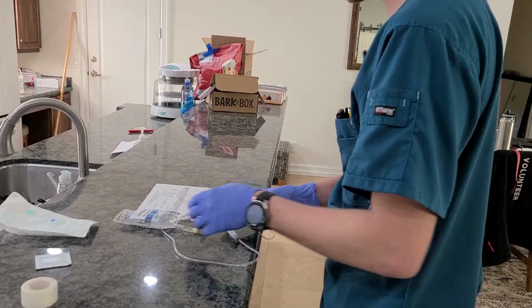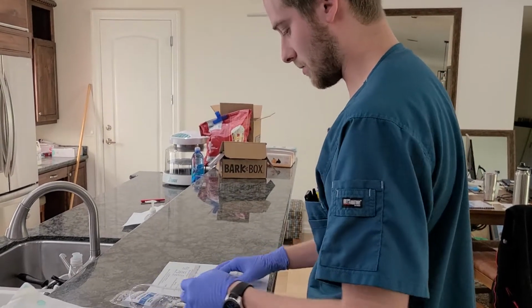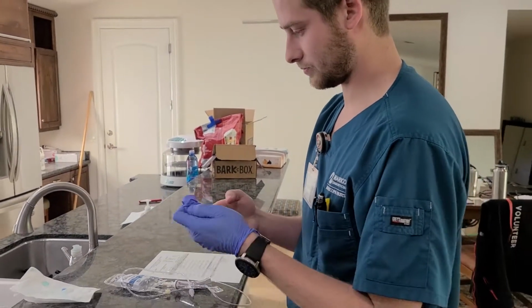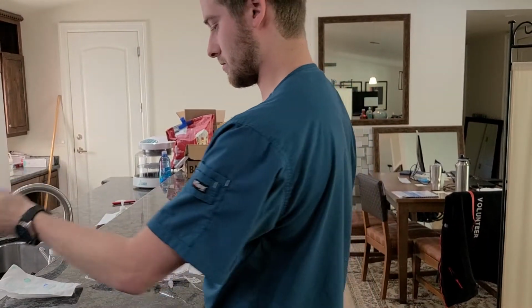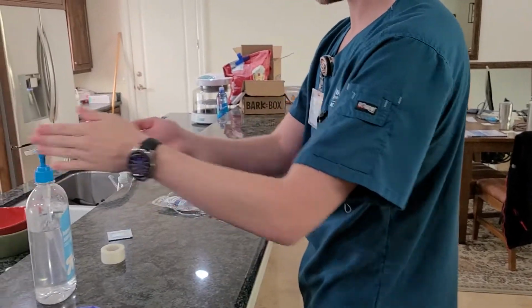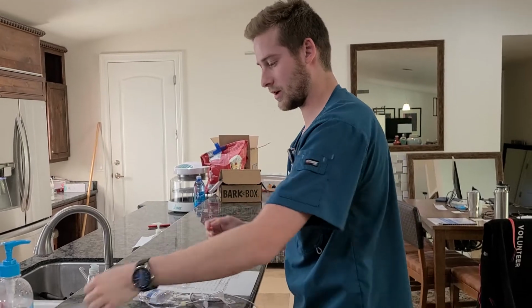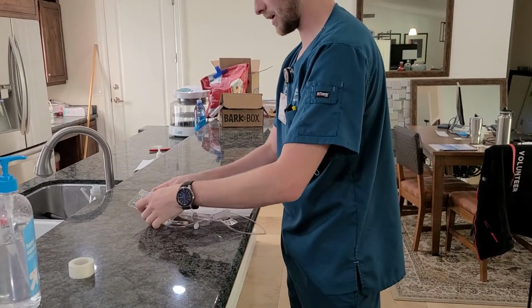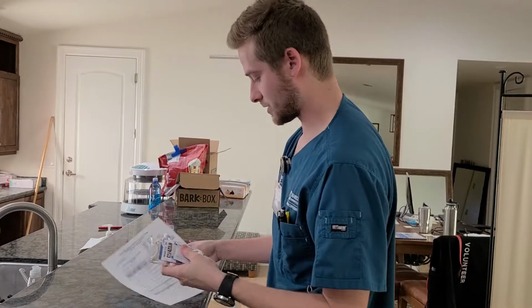Now that my label is made, I have my medication and I have my MAR. I'm going to take off my gloves and throw them away per facility policy. I'm going to wash my hands, and then I will gather my supplies, which includes the alcohol prep pad. I have my medication ready, and I have my MAR. Now I am ready to enter the patient's room.